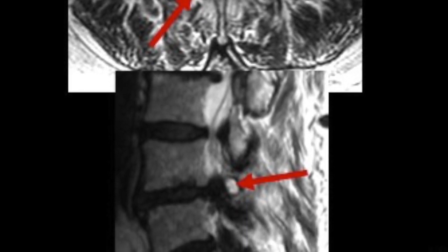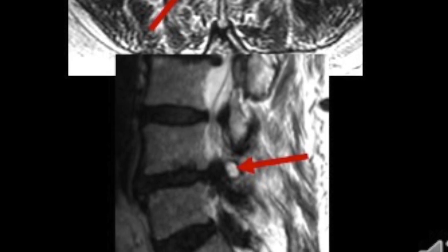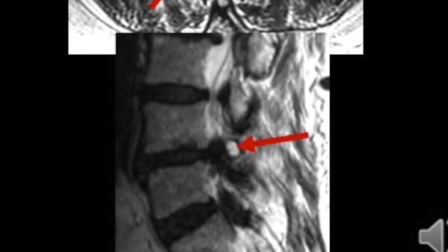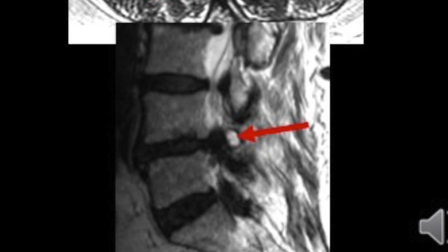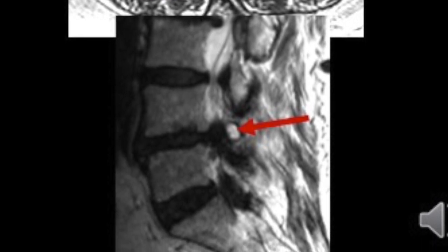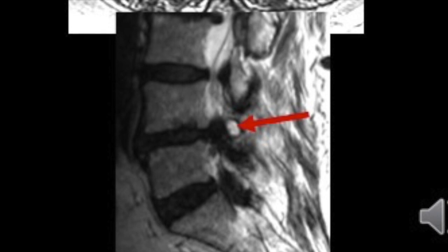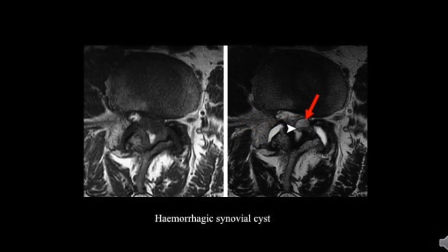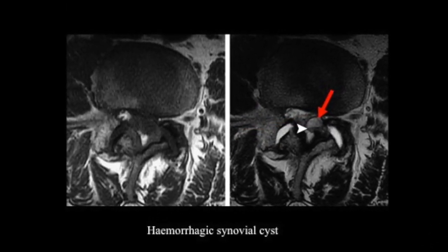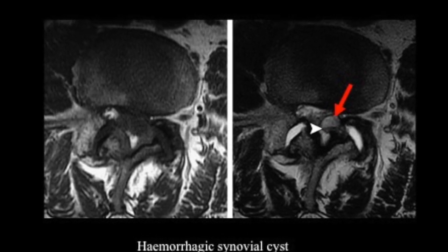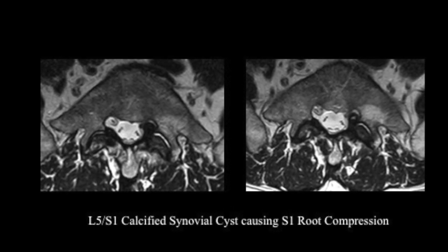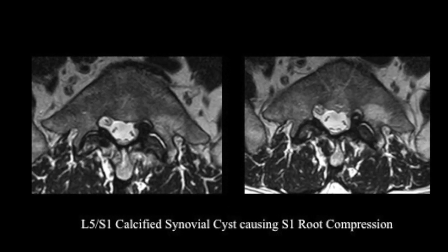On axial sections we might miss the synovial cyst if the imaging planes are not planned correctly. If a synovial cyst is identified on a sagittal image, the axial reference line should be planned to pass through it. An example of a hemorrhagic synovial cyst shows significant lateral recess narrowing and nerve root compression. Another example demonstrates a calcified synovial cyst causing S1 nerve root compression.